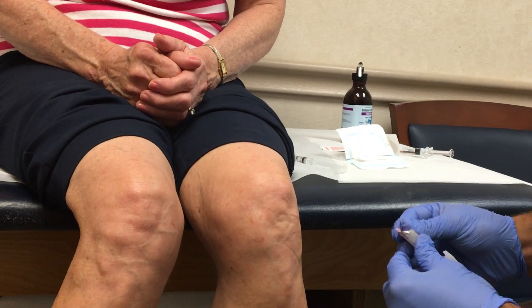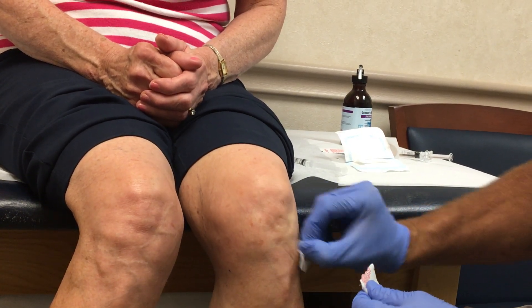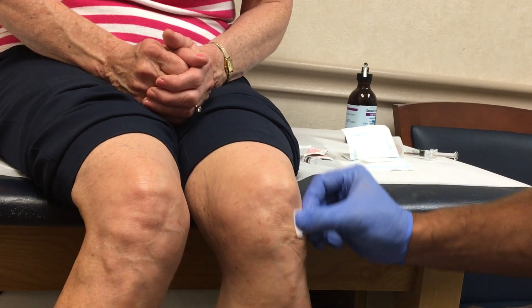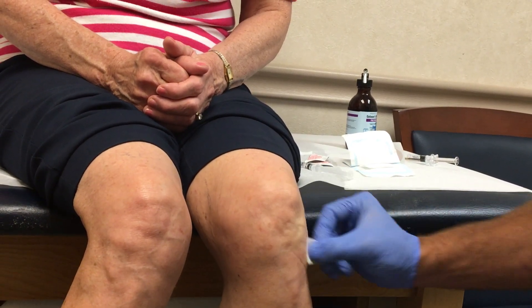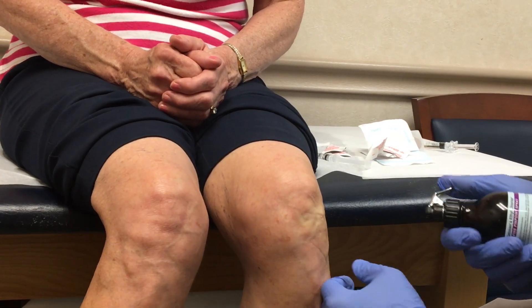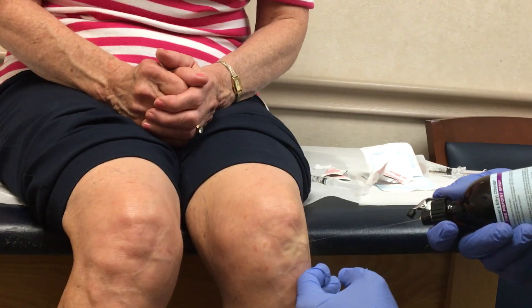Next I'll wipe the skin off to sterilize the skin with two alcohol wipes. And I'll use ethyl chloride to dull the pinch of the needle — I'll usually use it for five seconds or so.